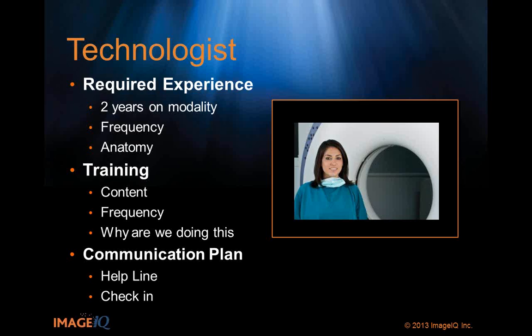We recommend 2 years on the modality for a technologist to participate. Now, the question is, is 2 years on the modality enough? And not necessarily. It really just depends. It depends on the anatomy and how often. The best example I can think of this from my imaging background is breast MR. So, breast MR has been around for a really long time, but has only hit mainstream in pretty recent years.